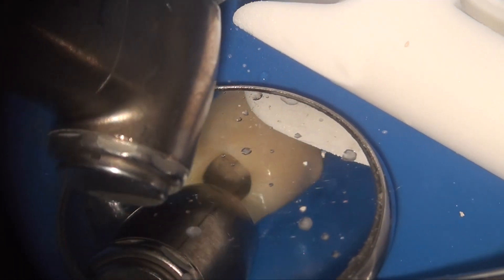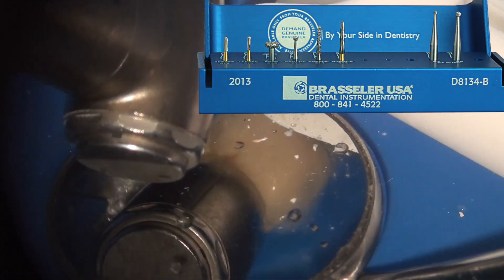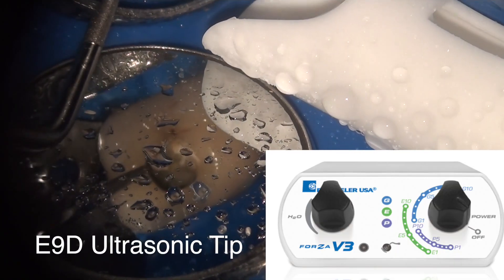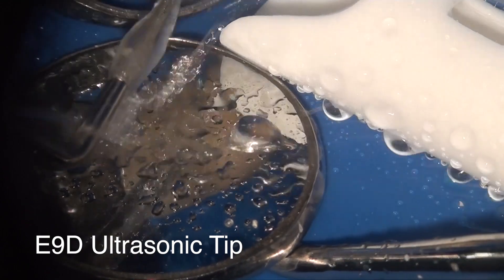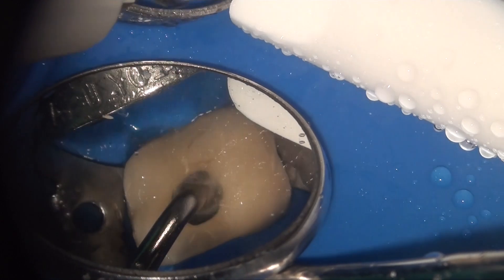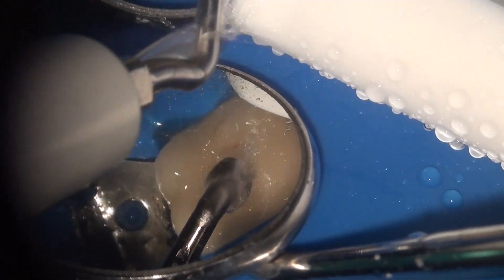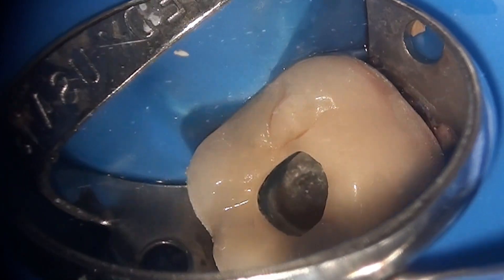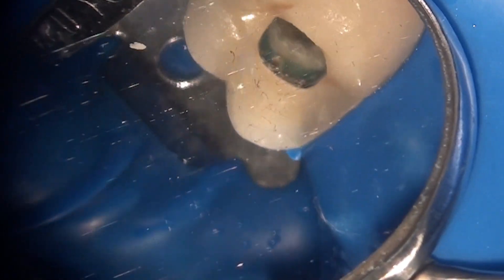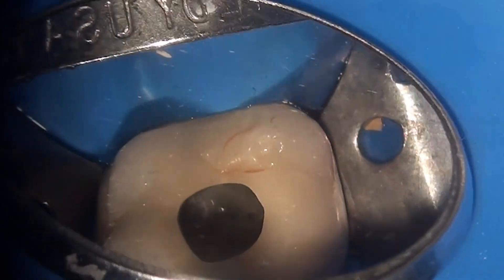I removed the provisional cavit using the saber cut burr from the Real World Endo Access Kit, and when the base of the cavit was near I switched to the Forza V3 Ultrasonic with the E9D tip to remove the rest of the cavit and the cotton. This helps avoid getting the cotton tangled up in the rotary burr. The access was cleaned and washed thoroughly. As you can see, only the palatal canal had been found and the buccal canals remained hidden after the initial search by the previous operator. Pus was present in the palatal canal.